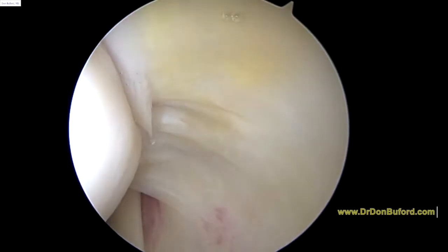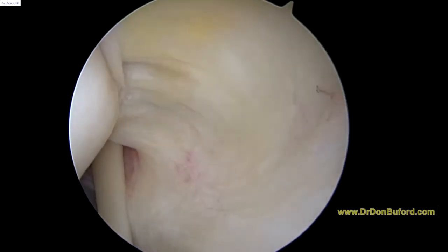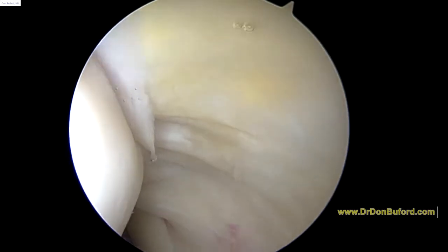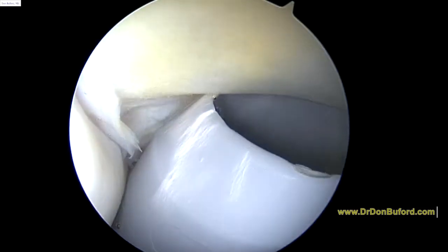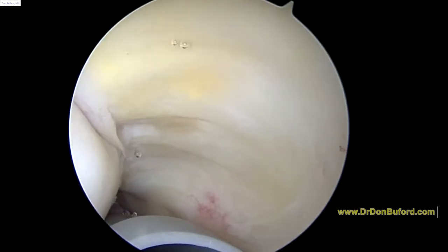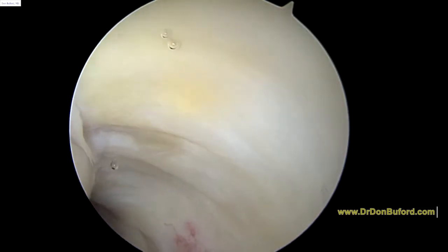Okay, so we're going to look up at the undersurface of the rotator cuff. This looks good here. No signs of any significant damage on the articular side. I see a little bit of yellowing. See just above the gray cannula how that color is a little bit different than over here. So we can appreciate that arthroscopically. We'll look at that from the bursal side.